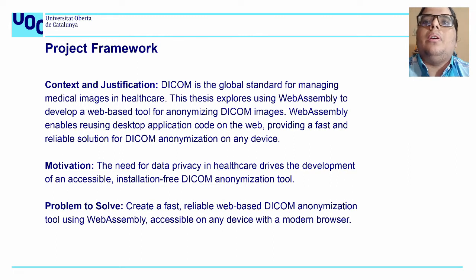Since we can always take the code base existing for desktop applications and in a streamlined way turn them into web applications. The motivation for this project is that in the modern era, and more specifically in healthcare, the need for data privacy drives the development of an accessible, installation-free DICOM anonymization tool. What problem does this solve? It creates a fast, reliable web-based DICOM anonymization tool using WebAssembly that is accessible from any device with a modern browser, even mobile devices.